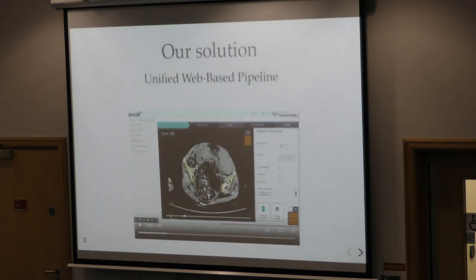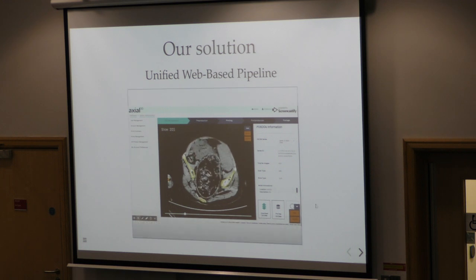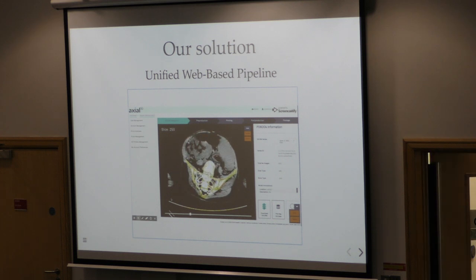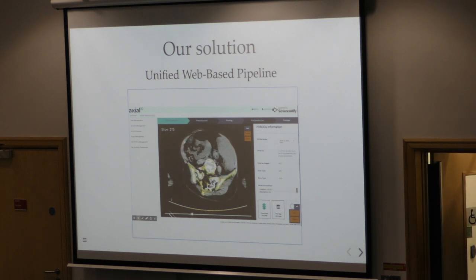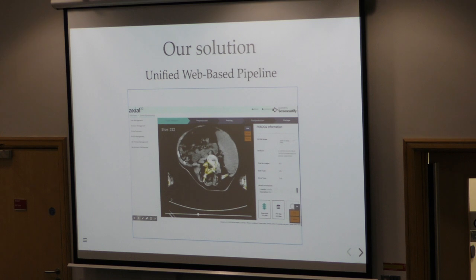So our solution, what we've been attempting to build for the last while, is a unified web-based pipeline that accomplishes all these tasks in a single workflow that a person can use without any great expertise in the individual steps, and still produce a very high quality final product. I was hoping to have more screenshots of this, but this is just one of the single steps, where we're verifying some of the DICOMs we received, and this is an overlay of a heat map of certain feature detections happening.